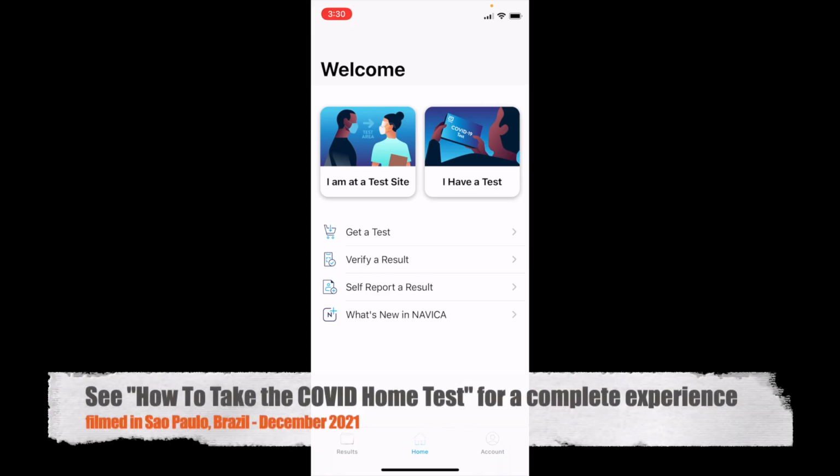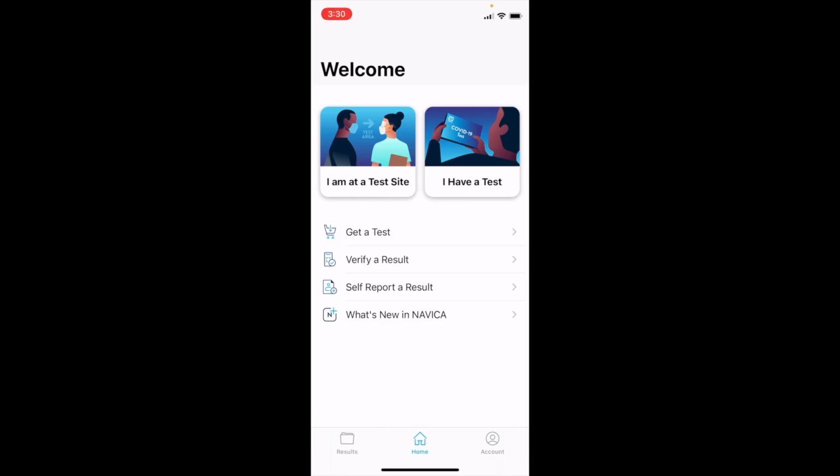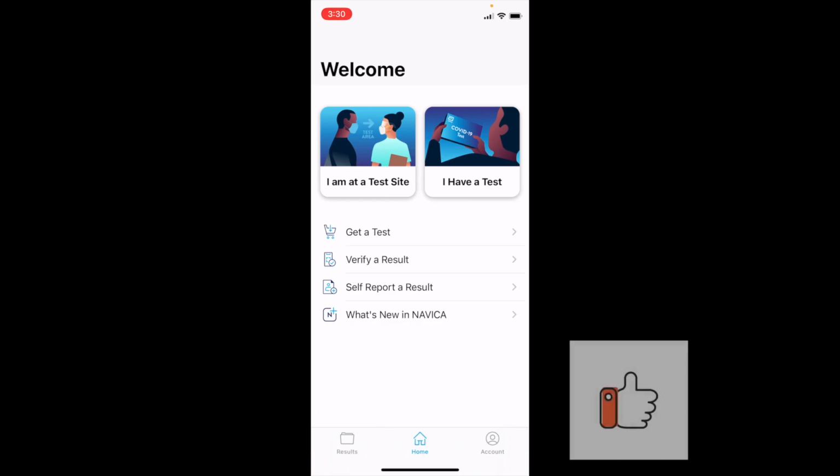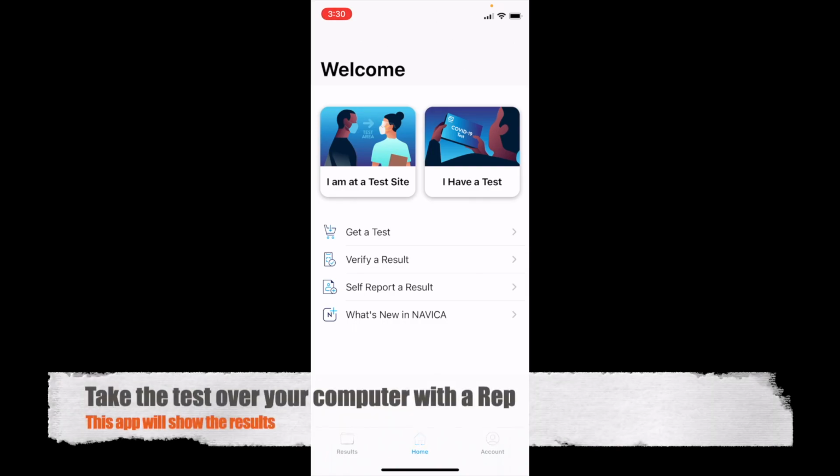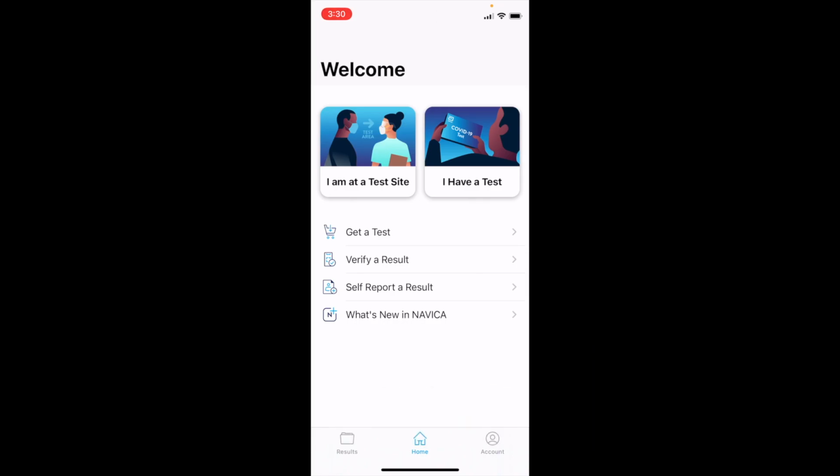And remember, you only have 24 hours to do this. You can't do 72 hours like you used to be able to. Now it's within a 24-hour window. And for each person, you have to log out and then wait 15 minutes and log back in. So if you have children, any minors, you have to do the test, I believe, if they're over 2 years old. So just keep that in mind.